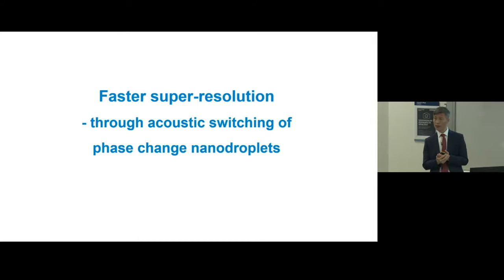If you remember, just now I talked about the optical imaging where they actually switch this contrast agent on and off. So they can do it very quickly because they can quickly switch them on and off. But in our bubble imaging so far, we don't really have a way to switch the bubbles on. Once they are injected, they're on. So we kind of have to rely on them to flow past. And if the flow is slow in the small vessels or microvessels, we will have a problem, right? We will have to wait. So if we can find some contrast agent that we can switch on acoustically and switch them off, then we could potentially speed things up.